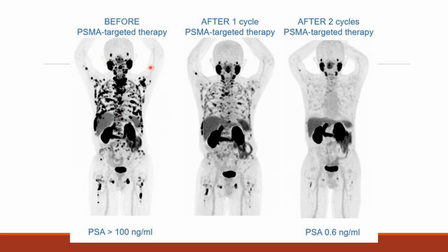It was normal to see parotid glands, but these are worse. Lacrimal glands, you see what looks like little eyeballs. But everything else that you see there, a little bit of bowel, you see it in their bone maybe, all through their ribs, axillary areas, probably lymph nodes. You see it in their neck and their chest, probably also lymph nodes.